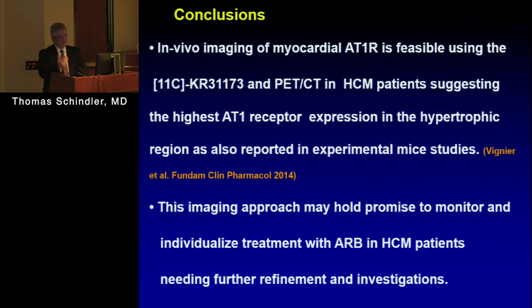In conclusion, that's what I just mentioned. In the future, AT1 receptor imaging may be a means to guide treatment options with angiotensin receptor blockers in these patients. And that may contribute to precision medicine in the individual patient.